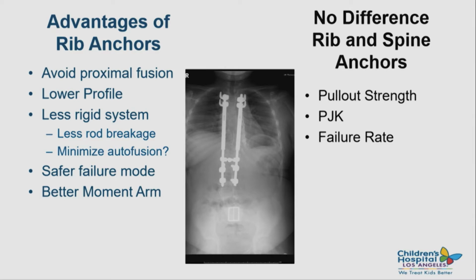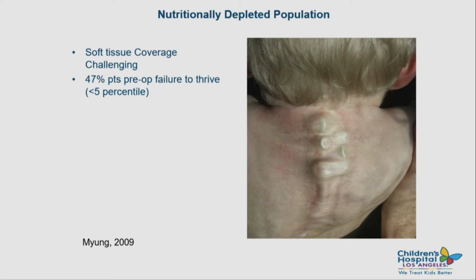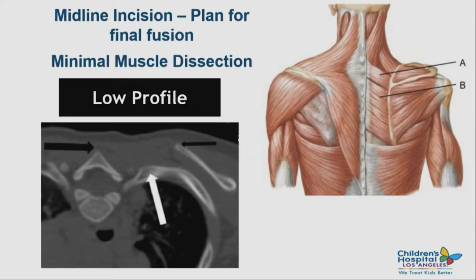Now, no difference between rib and spine. It looks like pull-out strength, PJK, and failure rates are pretty similar. I could not find any clear advantages to spine implants in the literature. So we're dealing with kids who are nutritionally depleted. And I think we've all had some kids with spine-based implants at the top of growing rods where you could almost read the serial number before the metal erodes through the skin.